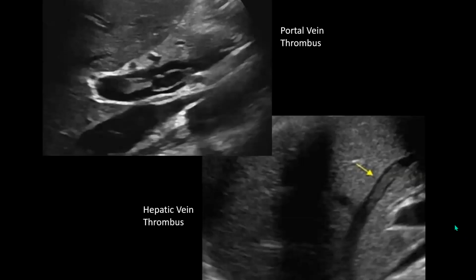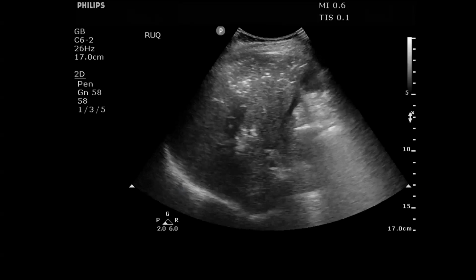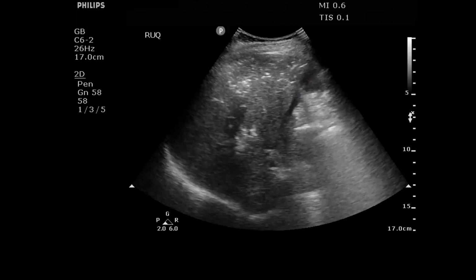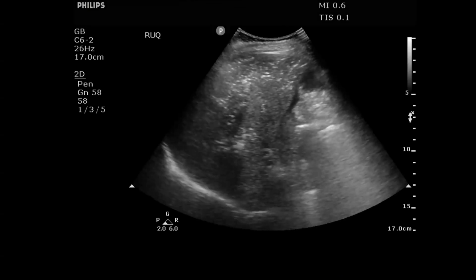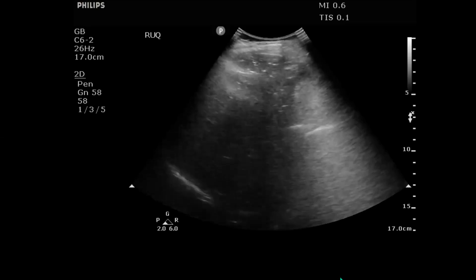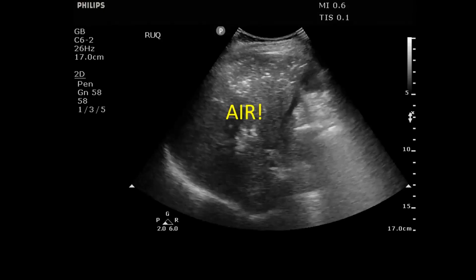So vascular problems, well, like anywhere in the body, you can have thrombus. So we can have portal vein thrombus, and you can also have hepatic vein thrombus. I've seen lots of portal vein thrombi, but I have not ever seen a hepatic vein thrombus, but they can exist. And then sometimes you'll see something that looks like this. I know you all are looking at this image and saying, there's maybe some fluid right here. And you're also noting these really small hyperechoic foci, and they seem to have this dirty shadowing. And of course, you all know that this is air. And really, there's no place for air in the liver. That should not be happening.